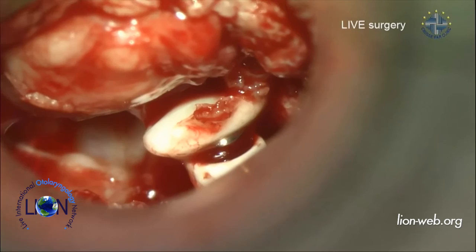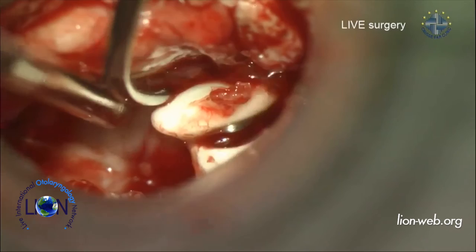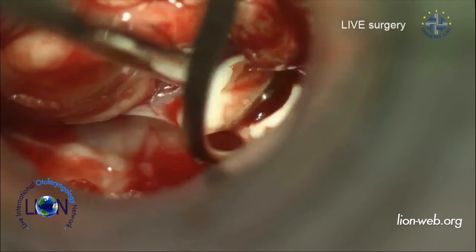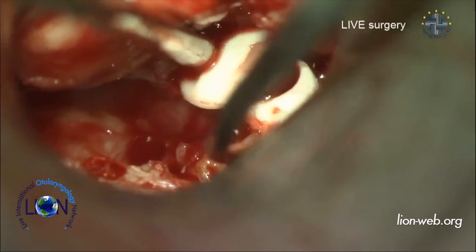So you understand that I place the shaft of the prosthesis as much as I can to the right because of the stapes, of course. On the stapes now, I think I'll have to perform a graft also because it's quite atrophic here. And it's adherent. So let's see if I can stabilize the shaft on the promontory. Because I need to find a way to stabilize the prosthesis to dissect the head more accurately. So here is better.